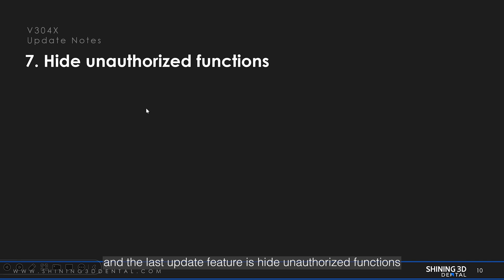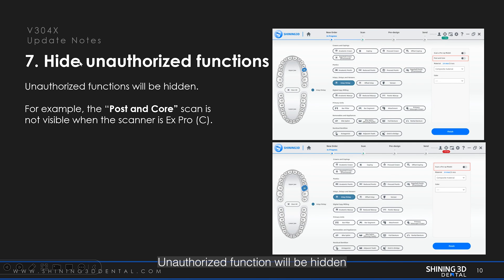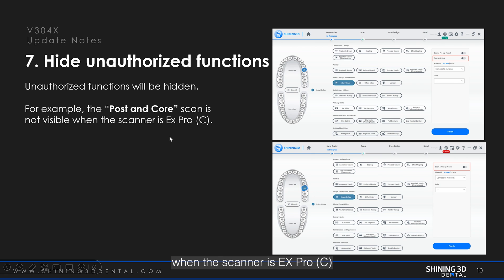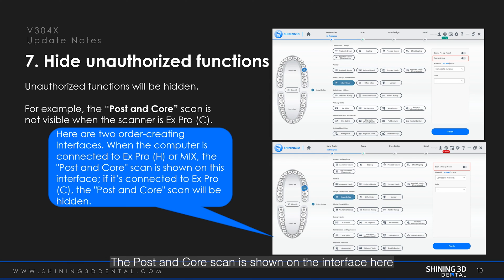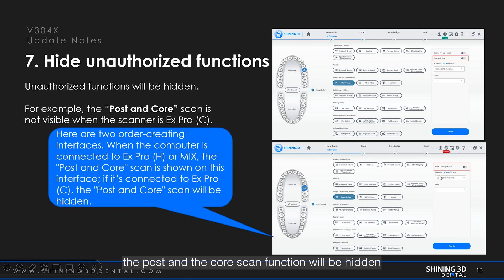The last update feature is hide unauthorized functions. Unauthorized functions will be hidden. For example, the post and core scan is not visible when the scanner is the EX Pro C. Here are two order creating interfaces. When the computer is connected to EX Pro H or MIX, the post and core scan is shown on the interface. But if it is connected to the EX Pro C, the post and core scan function will be hidden, as you can see here.